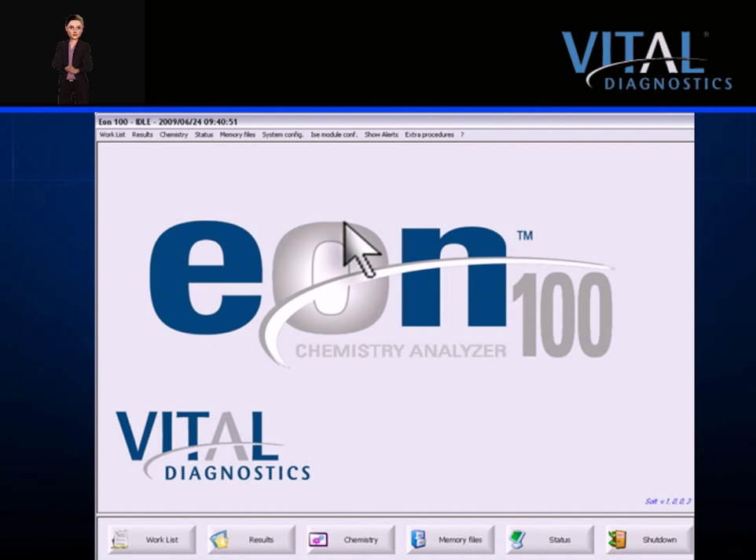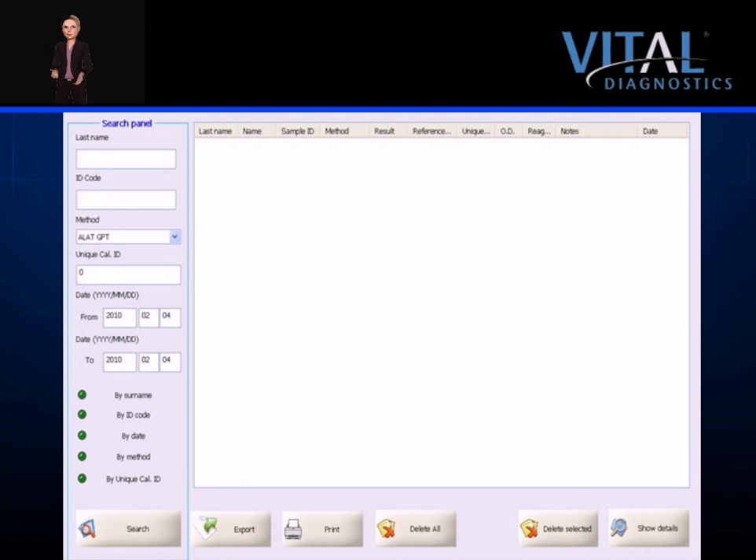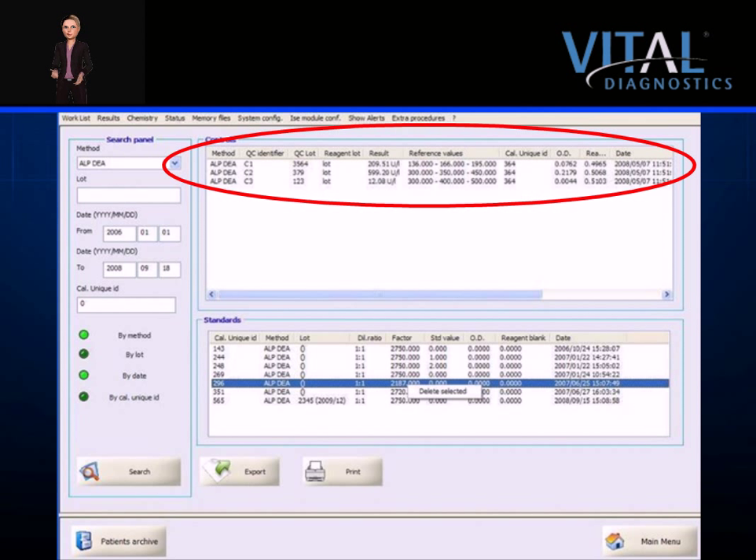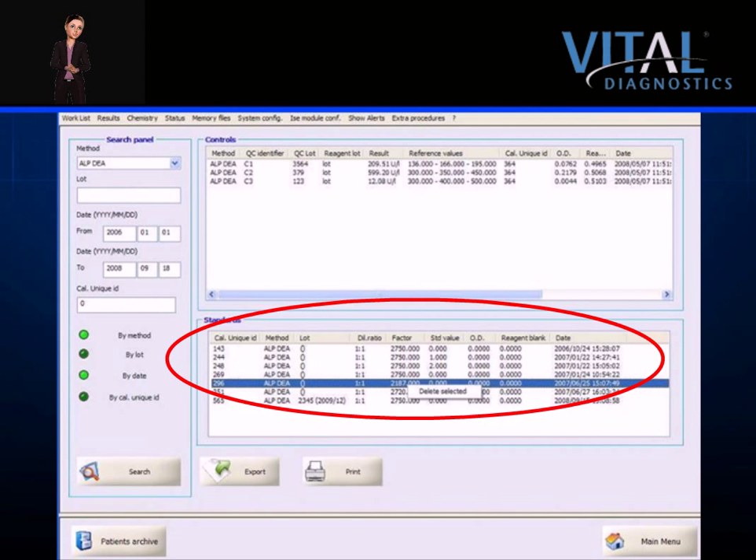All patient, control, and calibrator results are stored on the EON100 and are easily retrieved from the memory screen. Patient results are searchable by surname, ID code, date, method, or unique ID. Data can be exported by one click of the mouse. The system stores between 9,000 and 15,000 patient reports depending upon the number of methods run per patient. When maximum capacity is reached, the oldest data is automatically archived. Controls and calibrators are searchable by method, lot, date, or unique calibrator ID. The system stores up to 8,000 calibrator and control records.